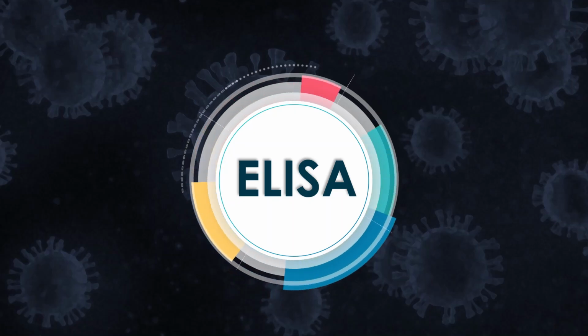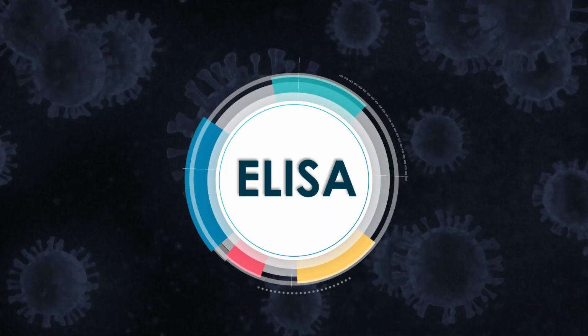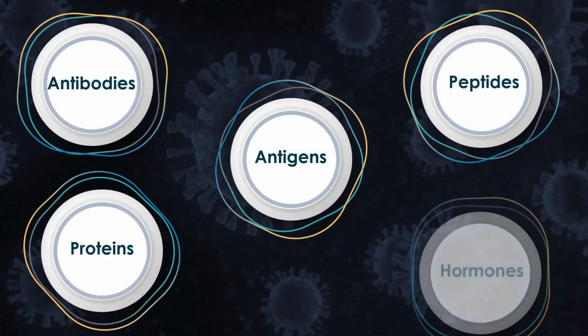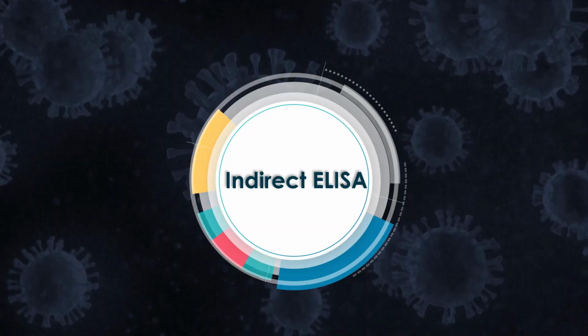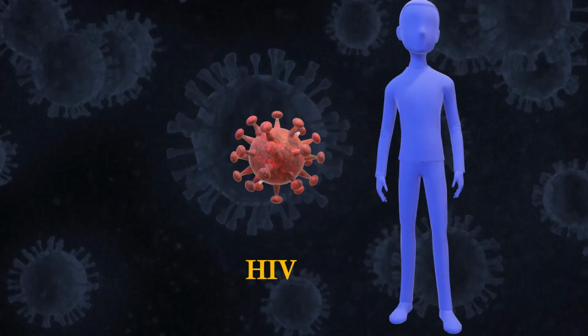ELISA, enzyme-linked immunosorbent assay, is a plate-based assay technique designed for detecting and quantifying soluble substances, such as antibodies, antigens, proteins, peptides, and hormones. ELISA tests are broken into several types. In this video we will talk about indirect ELISA. And we are going to see how it can be applied for HIV virus detection.